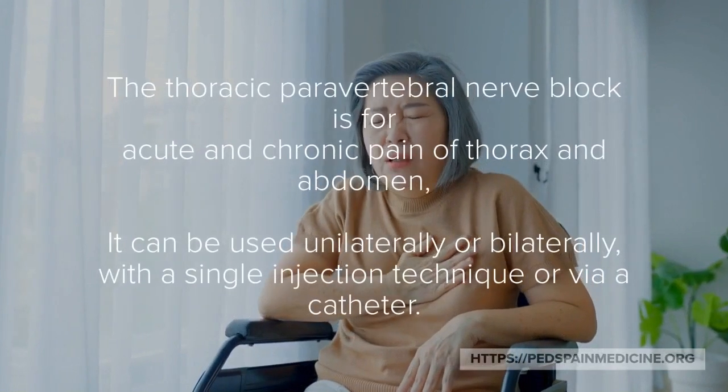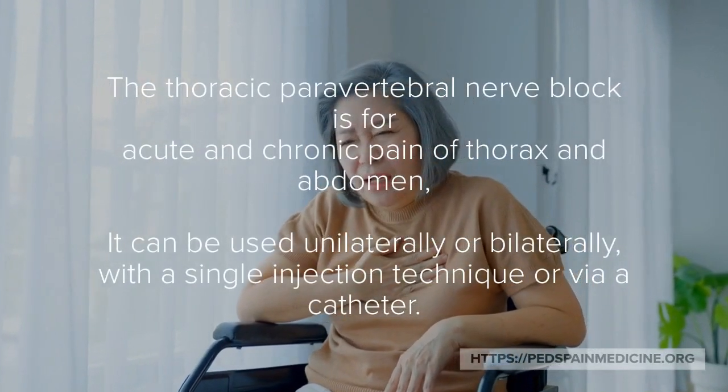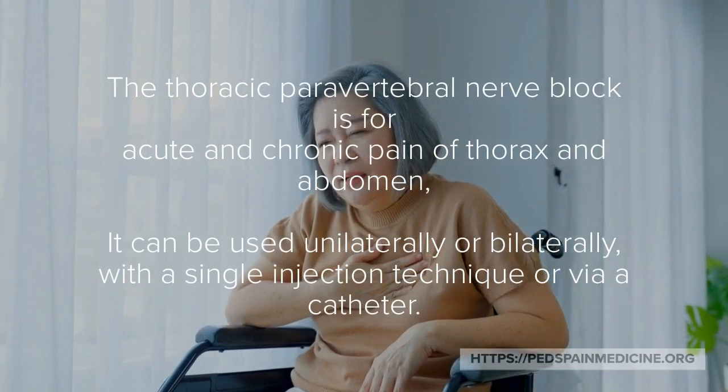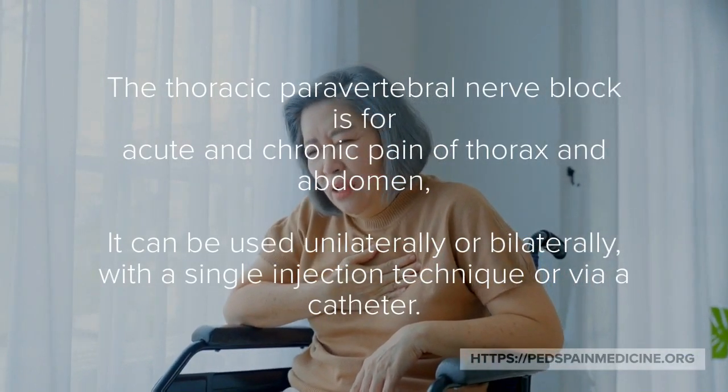The thoracic paravertebral nerve block can be used unilaterally or bilaterally, with a single injection technique or via catheter.